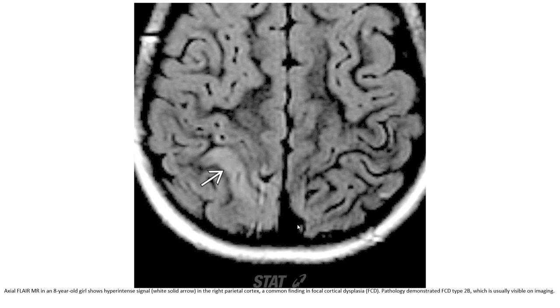So let's see the first case. This is the axial FLAIR image, showing a hyperintense signal in the parietal cortex — a common finding in focal cortical dysplasia. Pathology demonstrated focal cortical dysplasia type 2B, which is usually visible on imaging.